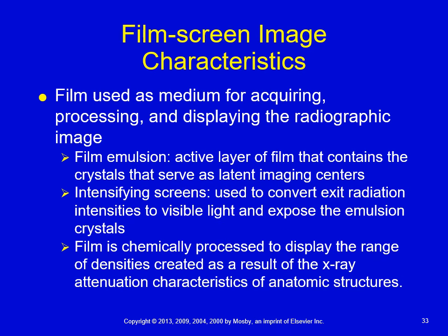All right, this next slide, or the information that is in this chapter, I'm going to skip. The reason I'm going to skip it is because the chances of you seeing film screen out in the real world is probably slim to none. You might still see CR applications, but that's even going by the wayside. Since this is no longer on the registry, I'm not even going to focus on film screen characteristics because it's not going to be something that's important to you.